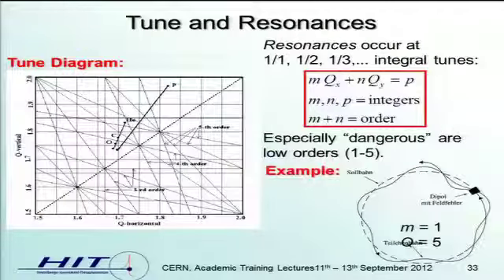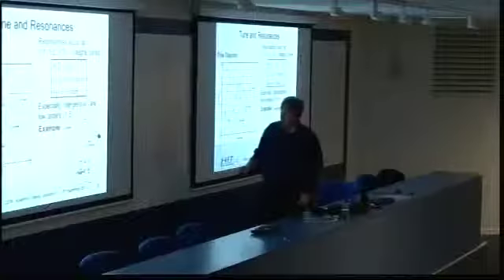So first we have to go to a third order resonance to bring the beam in a shape that the transverse Betatron oscillation gets bigger and bigger. But what you have to look for when you drive the machine, is that you stay away from these dangerous low order resonances and just bring the beam to the third order resonance just before the extraction.